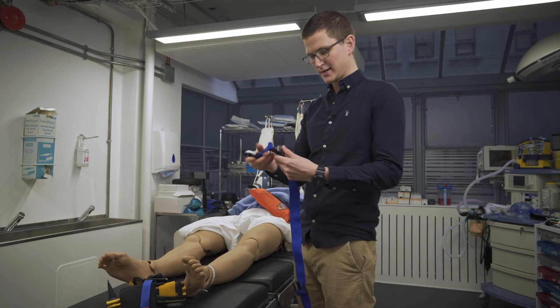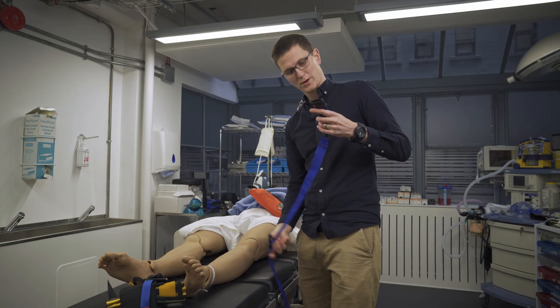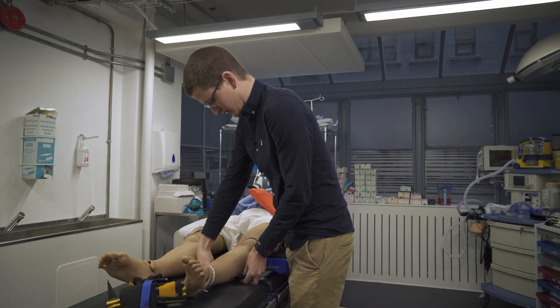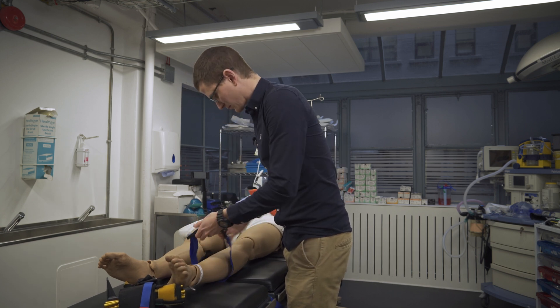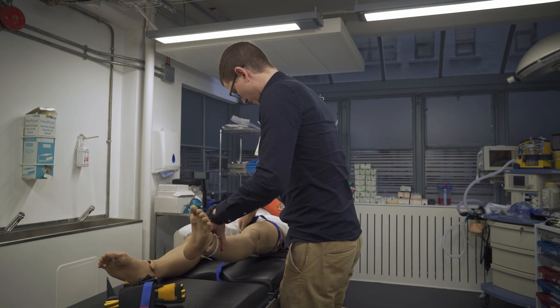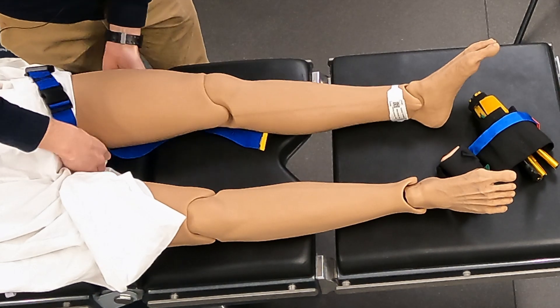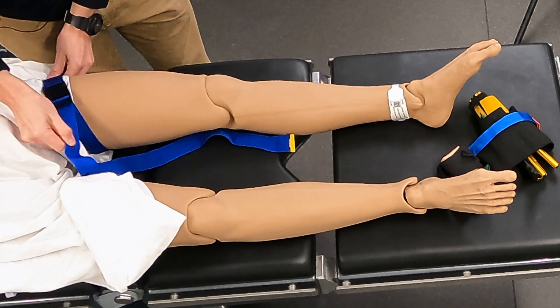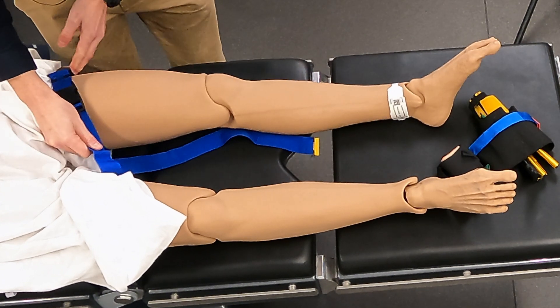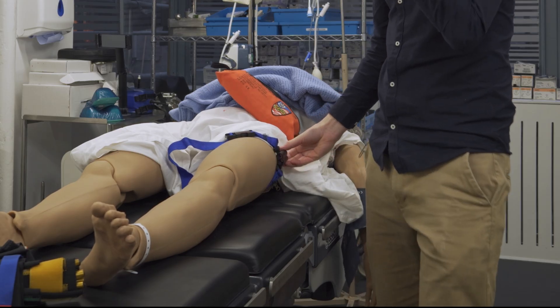As you can see, there are two holes for the pole. We apply the groin strap onto the patient — obviously gaining consent and all that. This goes as high up into the groin as possible and is tightened. It's a good idea to take anything out of the pockets if needed, and the two poles need to be on the outside of the leg.